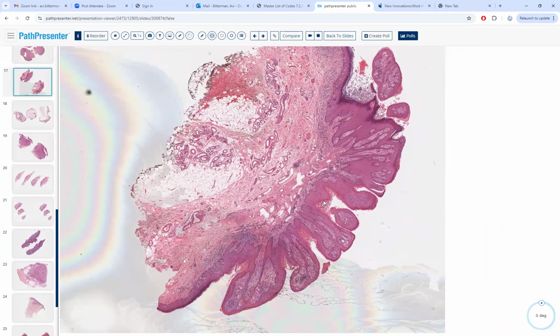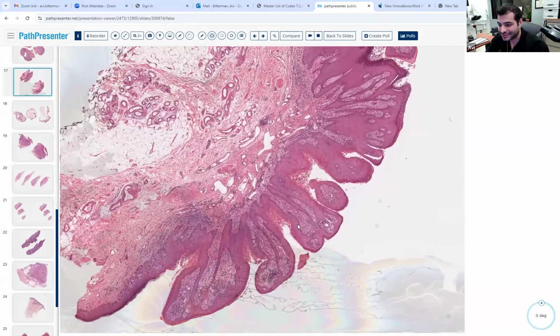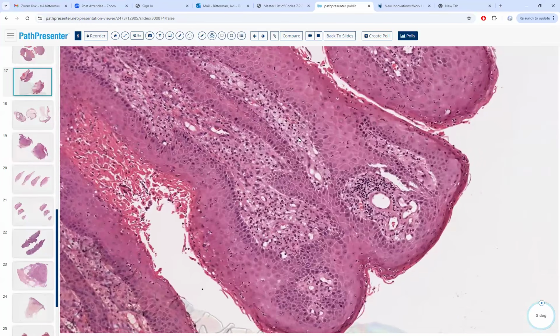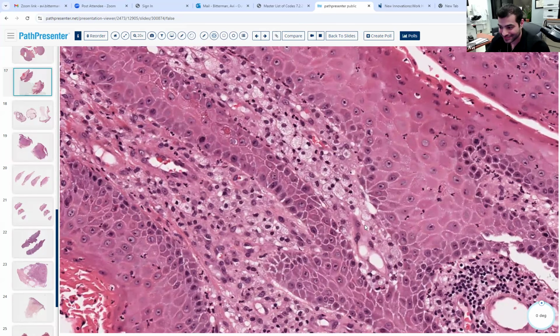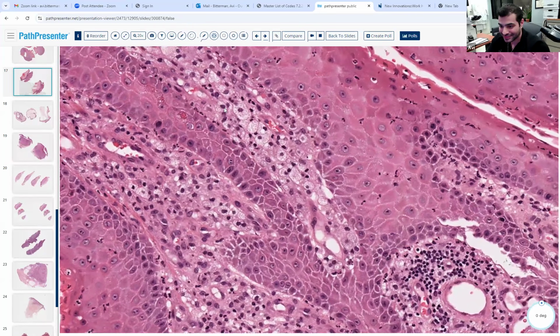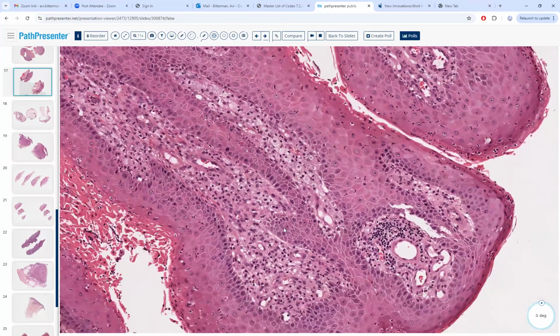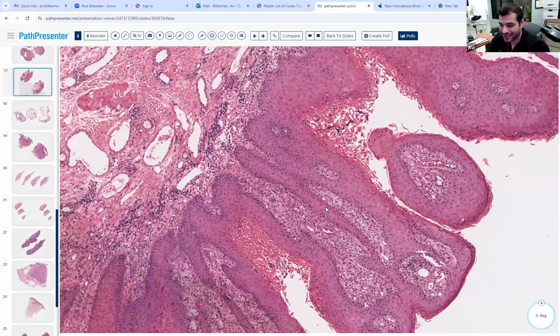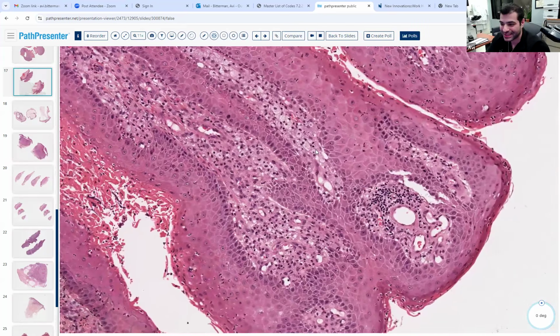So this is papillomatous. Yes. Let's see if there are any fat cells. Yes, foamy cells in the papillomatous epidermis. And what would you call it? What are they called again? The rete ridges are going up here, and the papillae, yeah. In the papillae, they have these foamy cells.